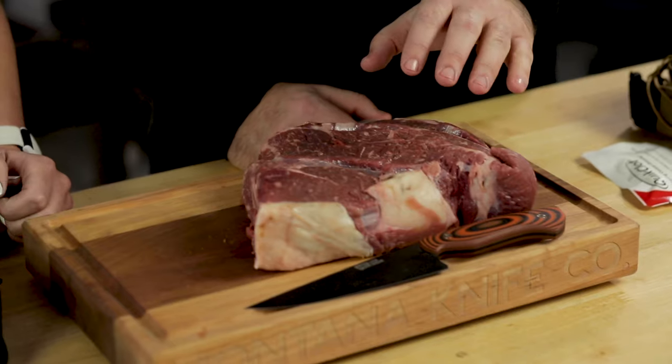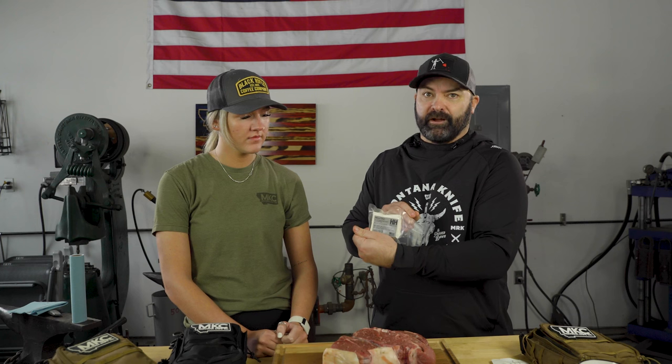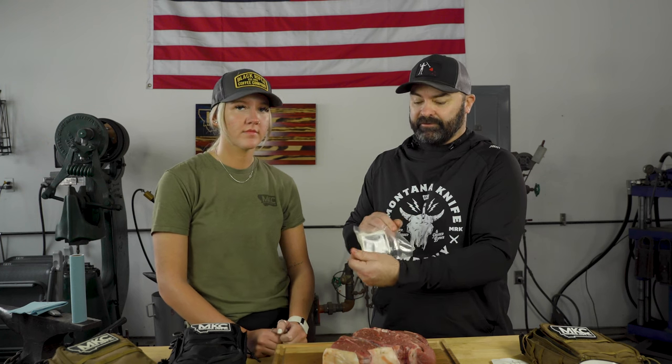I'm here with my medical assistant Sadie, and I'm going to demonstrate how to properly pack a wound with QuickClot gauze. This is a two-step process. We have our wounds, and the indication for this is you've got a major bleed that you cannot put a tourniquet on because of the location, or you're converting a tourniquet — making a pressure dressing after applying a tourniquet. First step is to take out your compressed gauze, not the QuickClot gauze, but the compressed gauze.